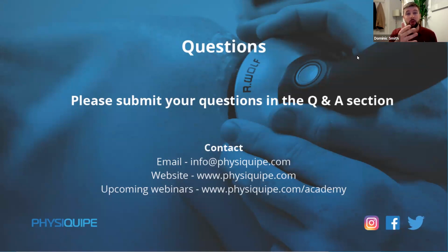But I think if you're comparing bar and millijoules, then you might be comparing radial and focused, which I think is quite difficult, because they are two individual things, like comparing TENS therapy and interferential. They both use electrical stimulation, but at different frequencies and wavelengths. So it's quite difficult to directly compare in some cases. Yeah, perfect, thanks. So just a couple more then.